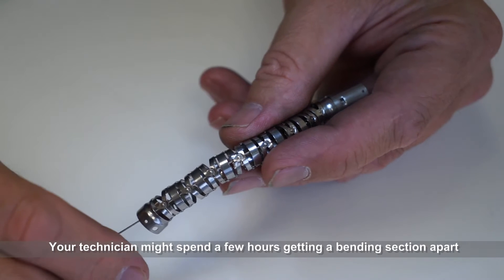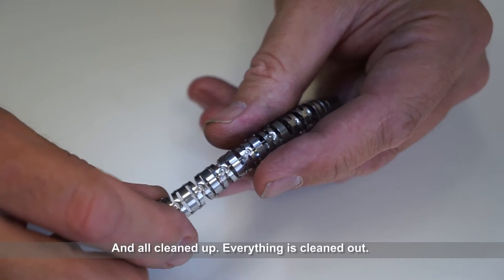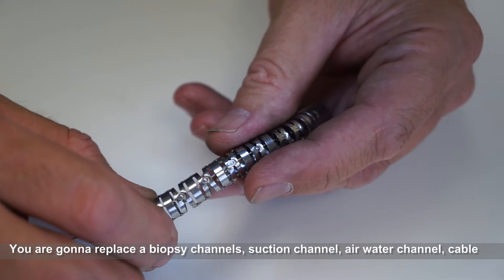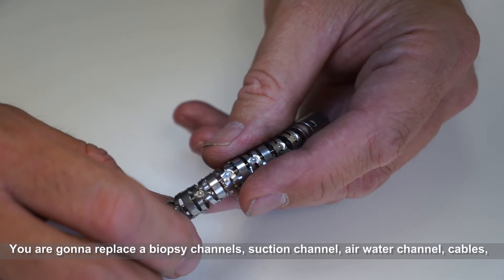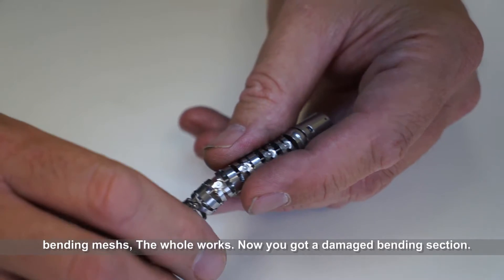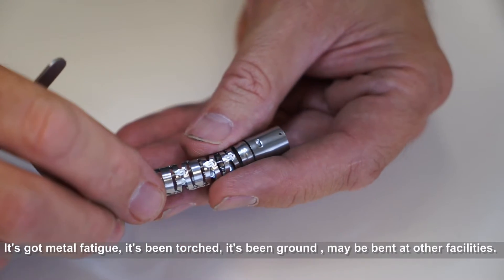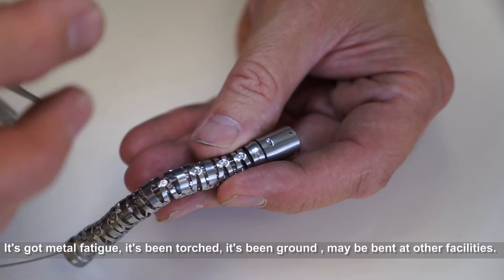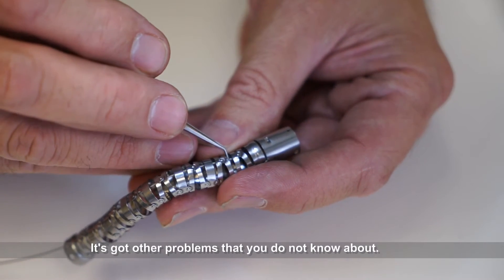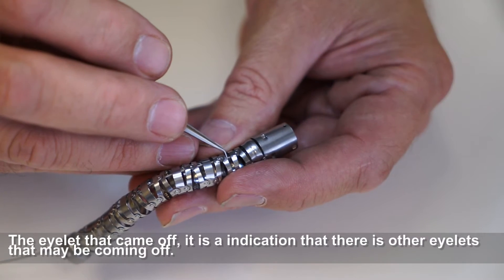Your technician might spend a few hours getting a bending section apart, all cleaned up and everything cleaned out. You're going to be replacing a biopsy channel, a suction channel, air water, cables, bending mesh — the whole works. Now you've got a damaged bending section. It's got metal fatigue. It's been torched, it's been ground on. It's maybe been to another facility and has other problems that you don't know about.